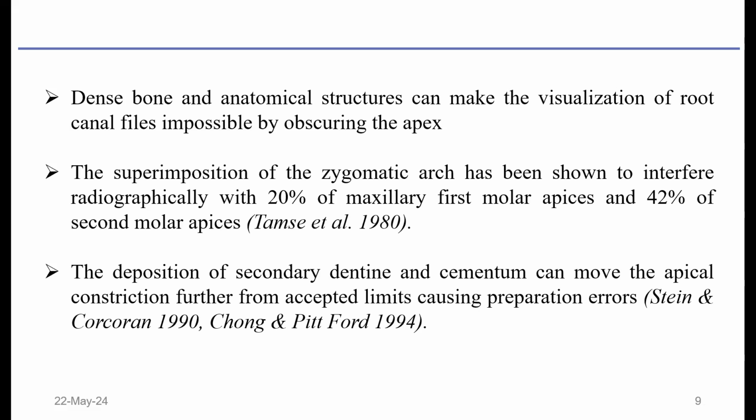Dense bone and anatomical structures can make visualization of the root canal files impossible by obscuring the apex. The superimposition of the zygomatic arch has been shown to interfere radiographically with 20% of the maxillary first molar apices and 42% of the second molar apices.